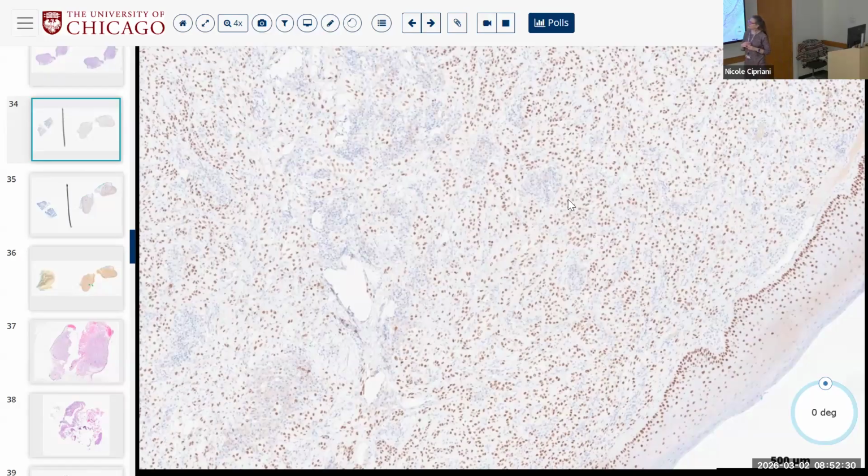So hyalinizing clear cell, while it's morphologically somewhat myoepithelial-like, is immunophenotypically not, right? HCCC is negative for the contractile markers, negative for SMA, calponin, desmin, and negative for S100 and SOX10. Whereas myoepithelial should have some of them or one of them. So just P40, P63 being positive doesn't necessarily mean it's myoepithelial. Do your myoid markers, your S100, SOX10. You've got to find another one of those.